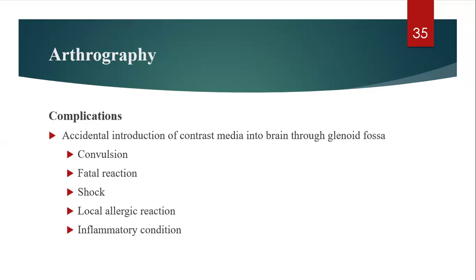The complications of arthrography include accidental introduction of the contrast media into the brain that can happen through the glenoid fossa, which can eventually cause a fatal reaction, shock, local allergy, or inflammatory conditions.